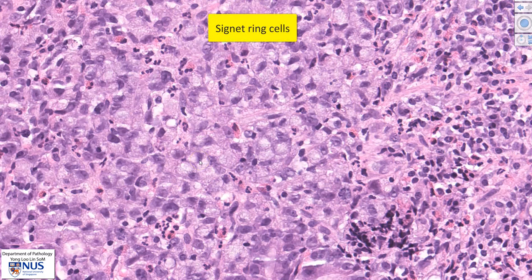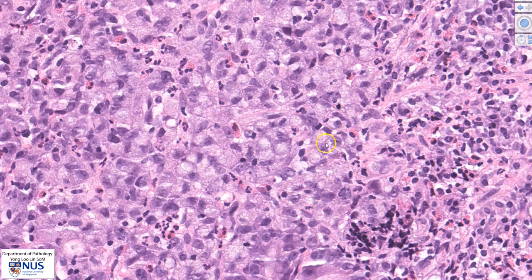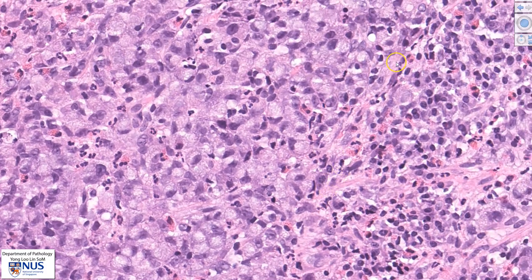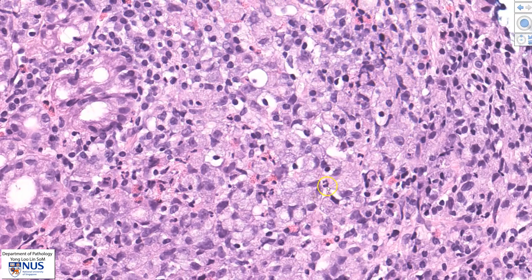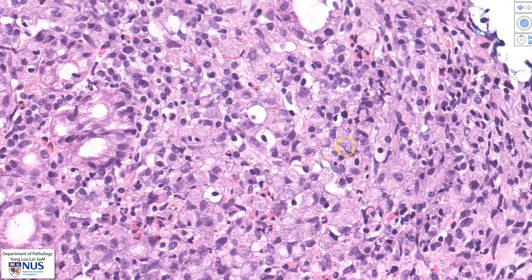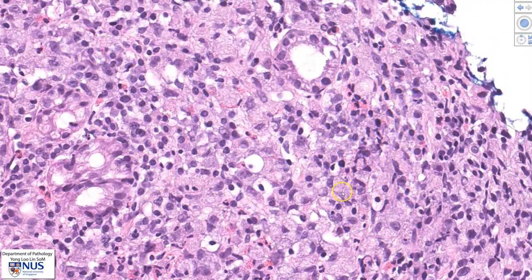These are known as signet ring cells because of their resemblance to signet rings. However, not all cells have a signet ring appearance — some of the malignant cells do not show a very indented nucleus. So we have a mixture of signet ring cells as well as non-signet ring malignant cells.